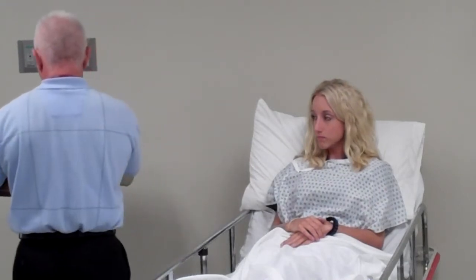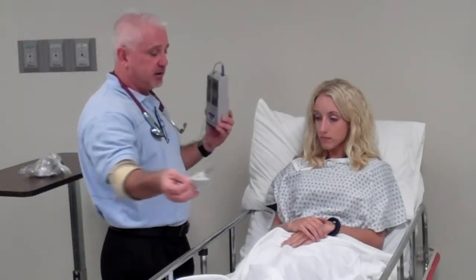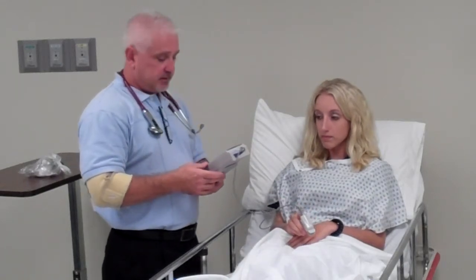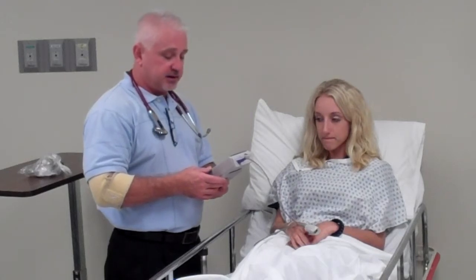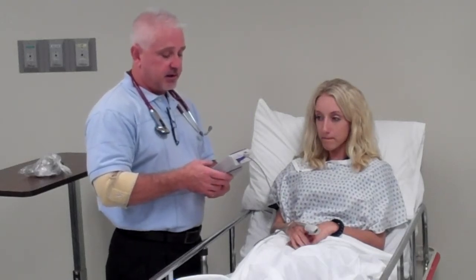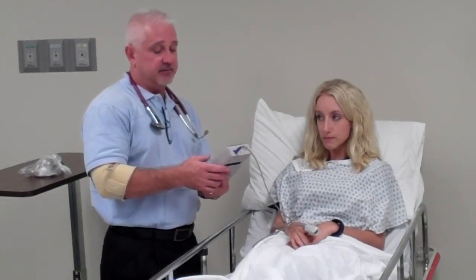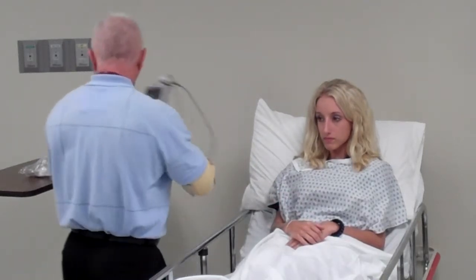I then would take my pulse oximeter, which measures the oxygen saturation in her arterial blood. It's actually the saturation of her hemoglobin. If she hasn't had exposure to carbon monoxide, it should be a pretty good indication, if she has good perfusion, of what her O2 saturation is, how saturated her hemoglobin is. And right now her saturation says that she has a sat of 90%, which is not adequate for somebody her age.